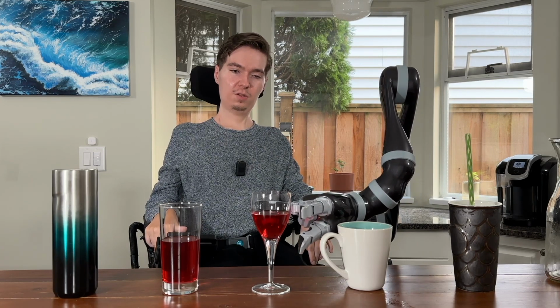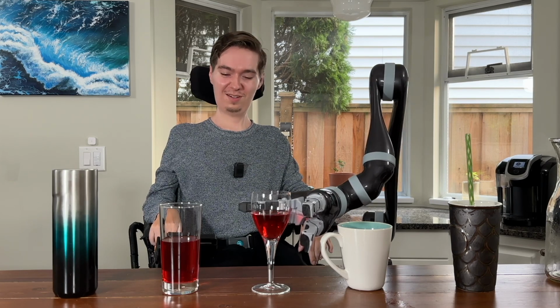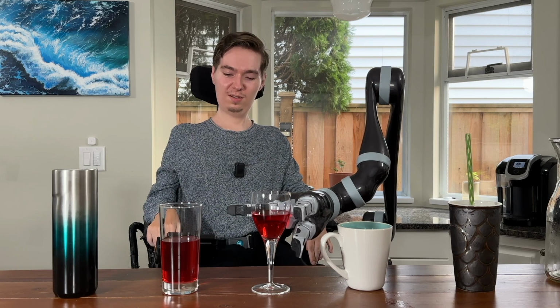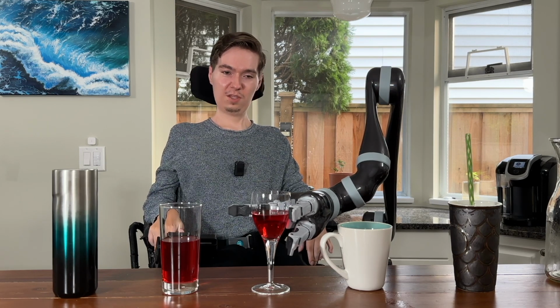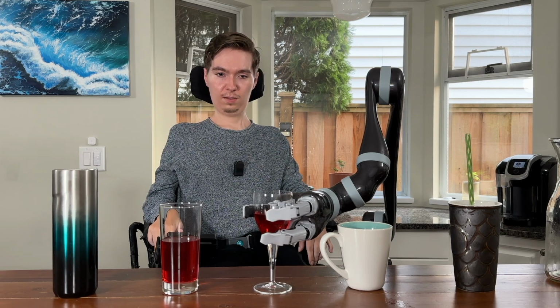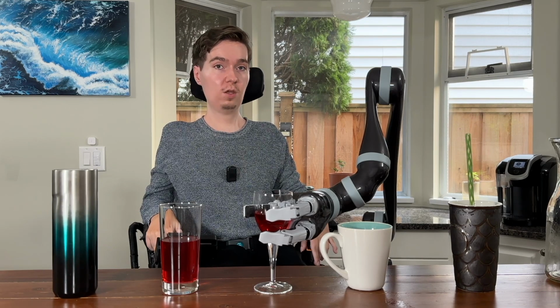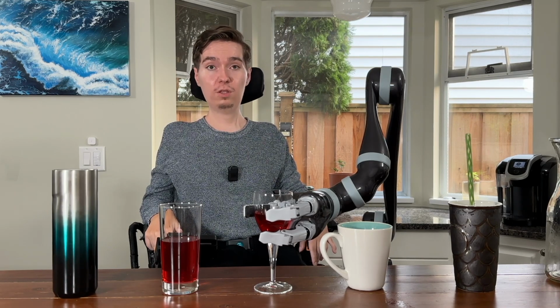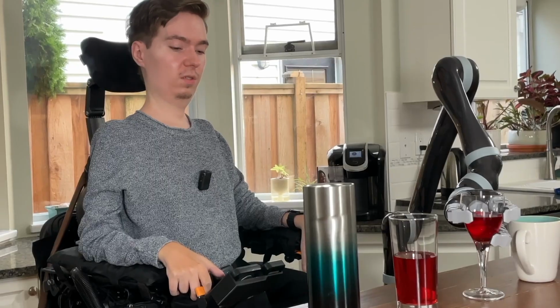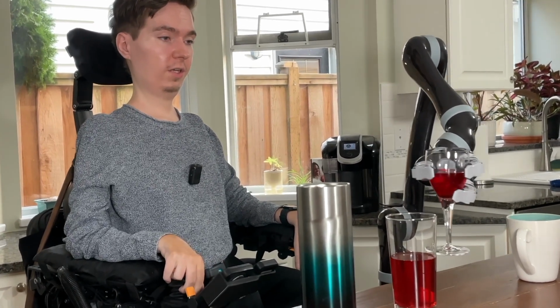Now let's try something a little bit more complicated, but not too complicated, which is this wine cup. And I'm just going to remind you that this is herbal tea and not red wine, but you do what you want to do. For me, we're just drinking some herbal tea. So I'm just going to grab this very gently here. And again, we're going to want to make sure that the cup is right in Jaco's palm. This allows Jaco's fingers to get a really good grip so that you're not dropping your favorite beverage all over yourself. So again, we're going to lift it up and bring it up to our mouth.